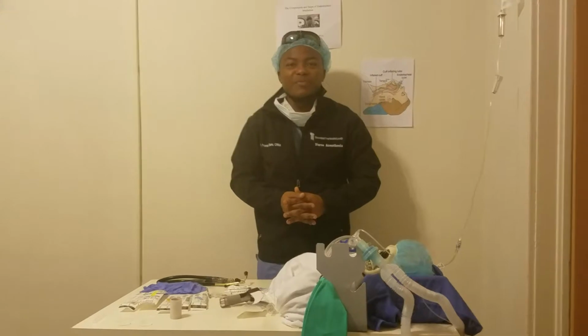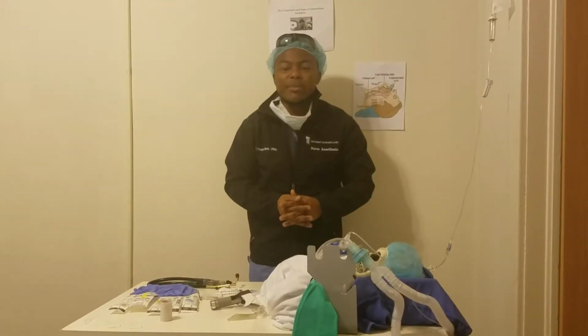We'll go ahead and watch a video now that will further show how this happens in a mannequin.